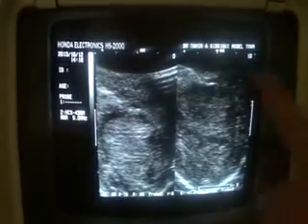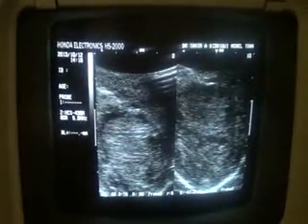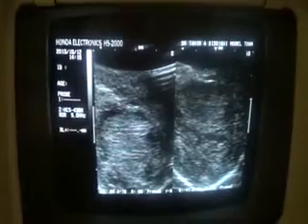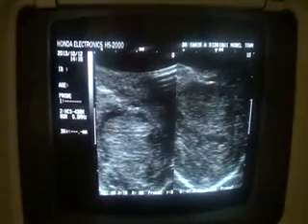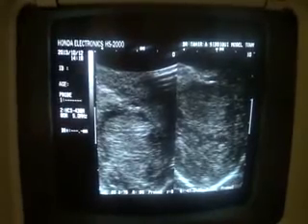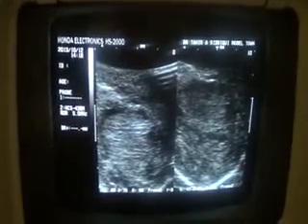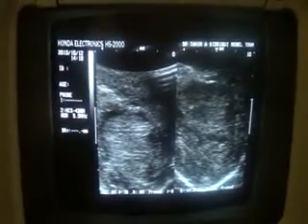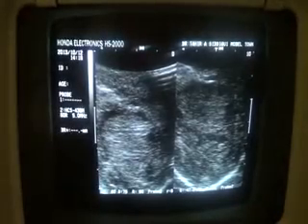This is the transverse section, and this is also a transverse section. This view was taken to show you the mediastinum testis, which is normal, and this transverse section shows multiple irregular focal lesions scattered throughout the testicular parenchyma of the right side.